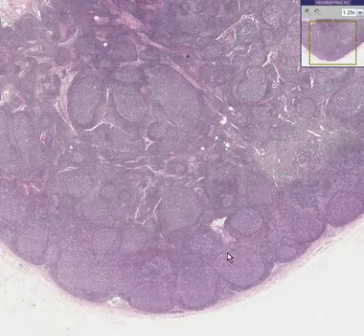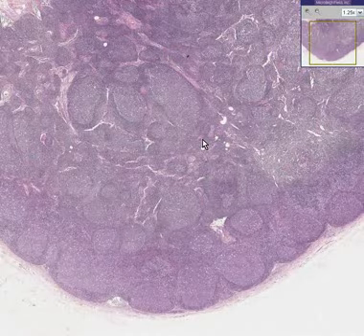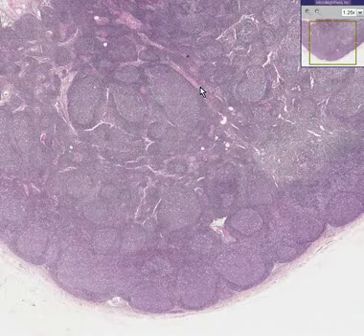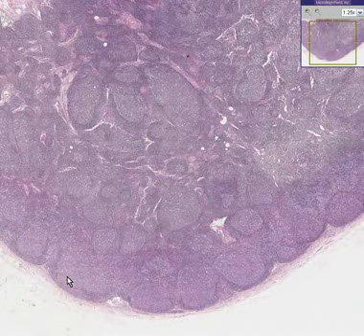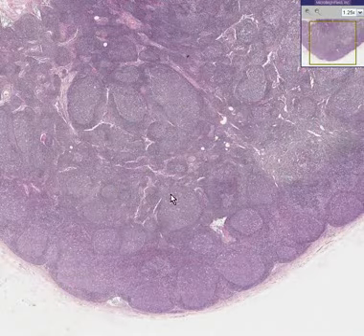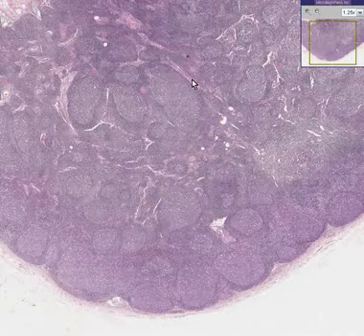That one is called sinus histiocytosis, or a hyperplasia of the medullary sinuses. So the two benign ways a lymph node reacts to inflammation, which is called hyperplasia, is either by a follicular hyperplasia, which this is, or a sinus histiocytosis, in which you have the prominence of the medulla.